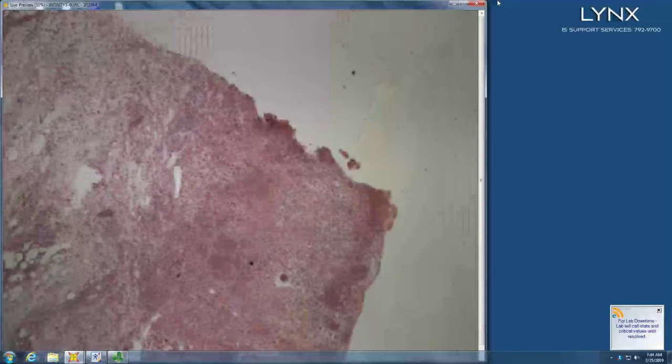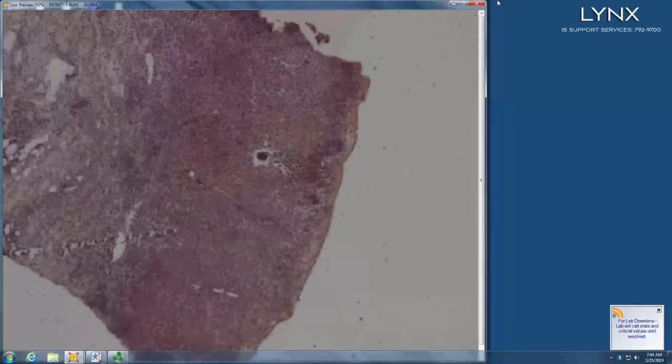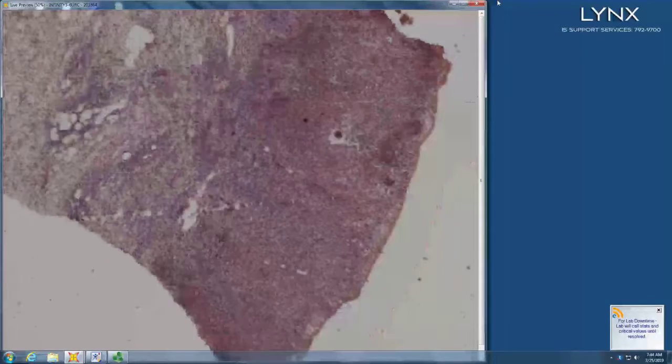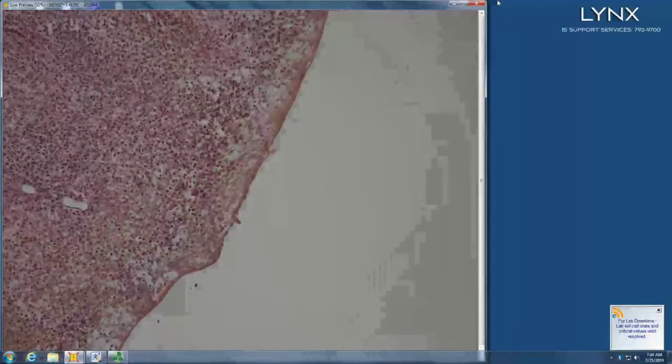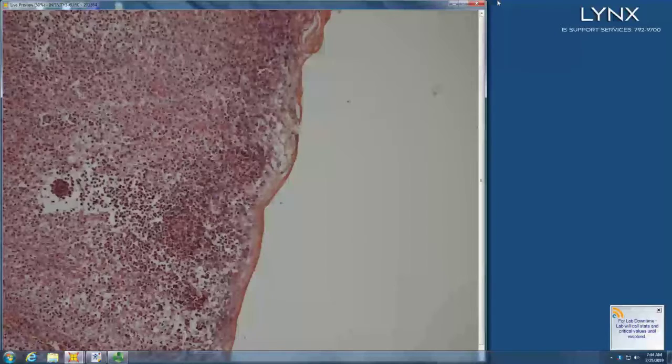Let's do this one. Dense infiltrate. What's the edema? Dense infiltrate, very neutrophilic, right? Sweet's. So PG, Sweet's, I would definitely have been there with you. Is your epidermis intact? Epidermis is not intact, kind of necrotic.